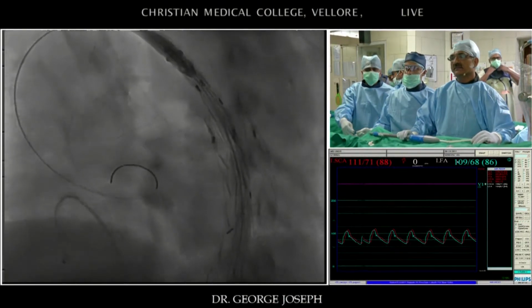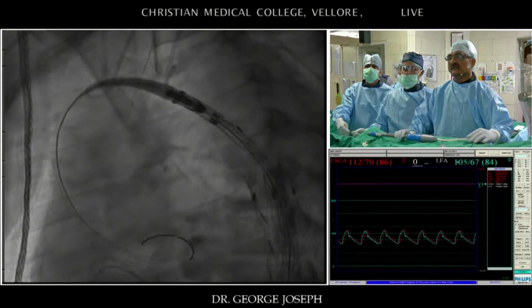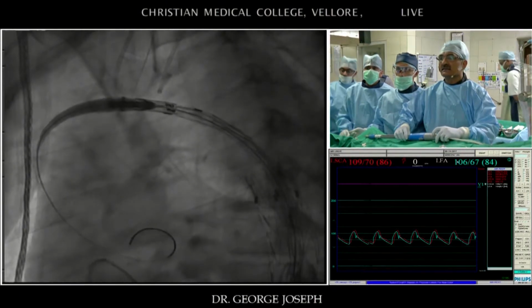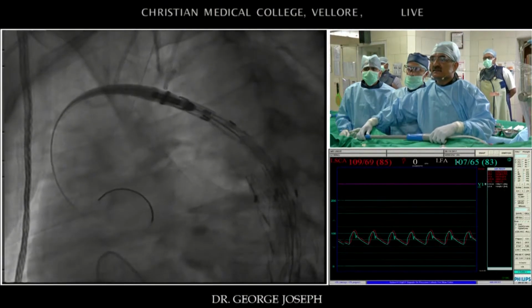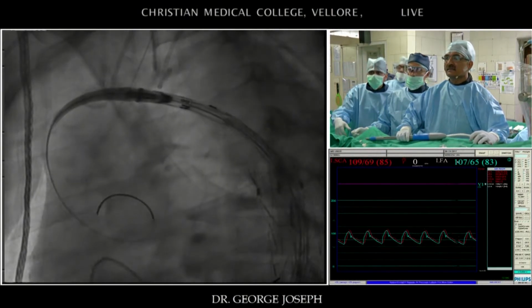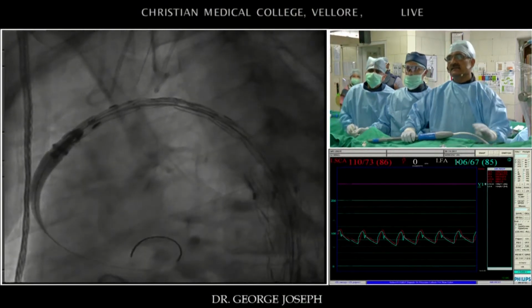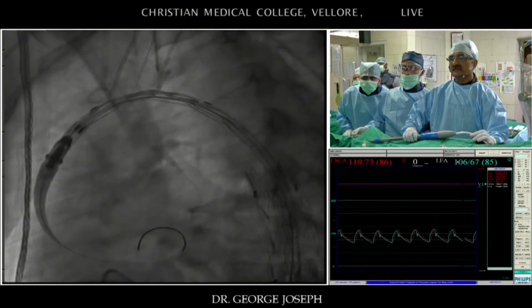Show the arch, please. Right, so here I go. Don't move the table. You can see that those 2 markers are superior now. There is a little rotation. One of the markers has become a little 8-ish, so I'm going to readjust that. Yeah, all right, so it's back to like a slit. You can see that those 2 markers are still like lines, not figures of 8.